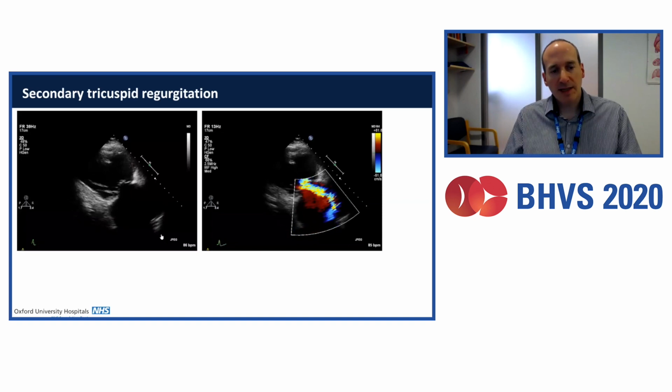And here's an example of that. So here's a right ventricular inflow view on transthoracic echo. We have a clearly dilated, adversely remodeled, very impaired right ventricle, tension on the papillary muscles, a tethered tricuspid valve, and clear, severe, if slightly eccentric, tricuspid regurgitation.